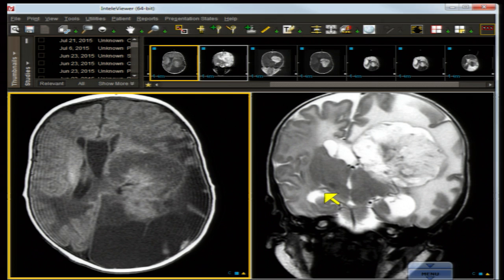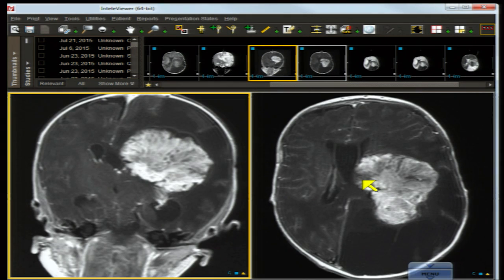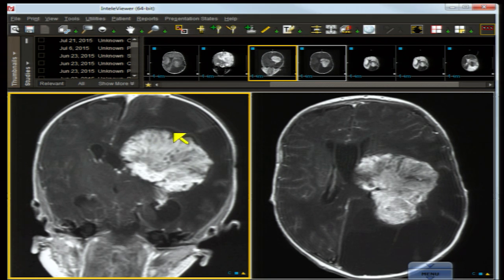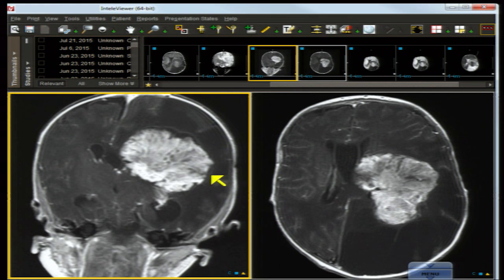There is ventricular dilatation — hydrocephalus — either from obstruction or overproduction. The temporal horns are enlarged. There is subfalcine shift and displacement of the uncus medially, raising concern for potential herniation of the brain — something that must be called out in your interpretation. The coronal contrast enhanced image demonstrates a large cauliflower-like, papillary mass in keeping with the name choroid plexus papilloma — very frond-like. There is a little inferior extension, so the differential diagnosis continues to lie between choroid plexus papilloma and carcinoma.